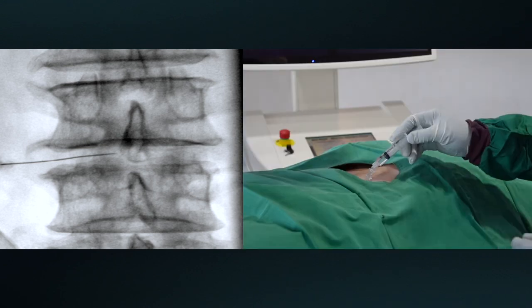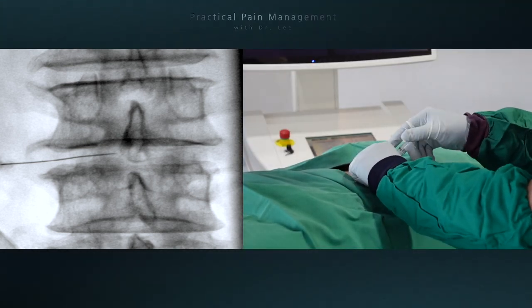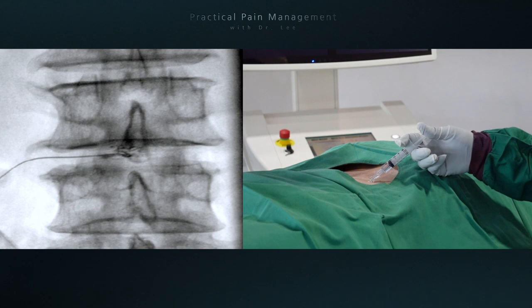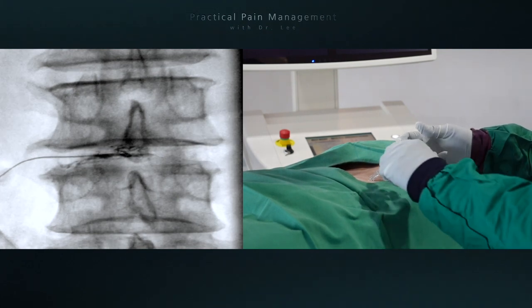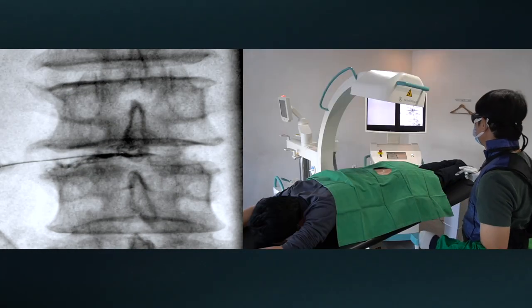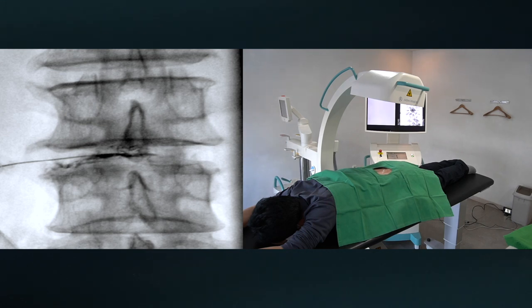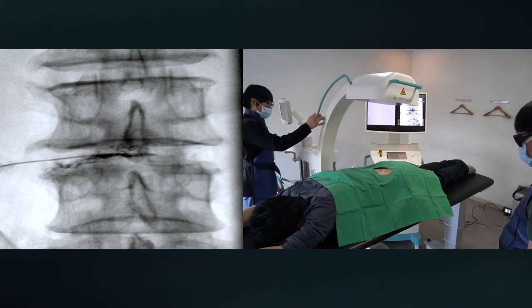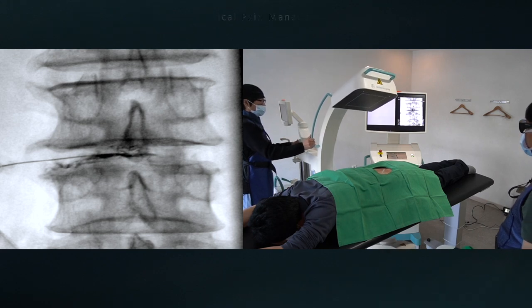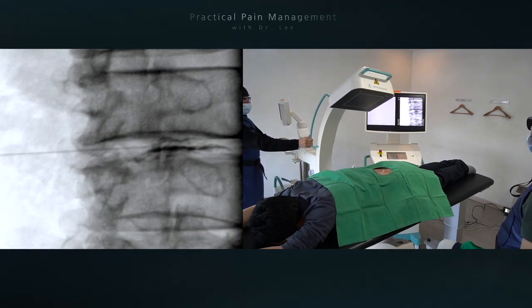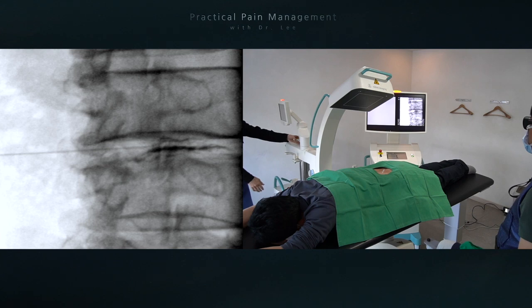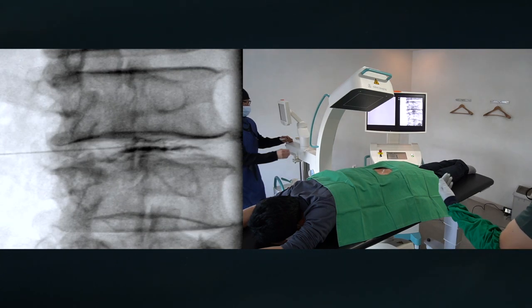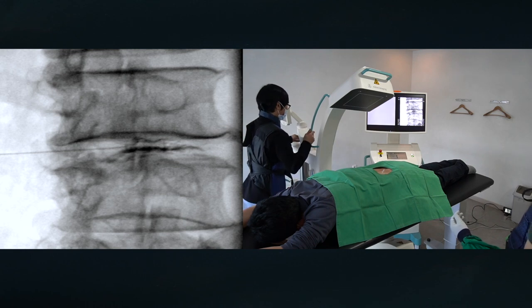I slowly introduce the contrast media into the disc. Control lateral oblique view — both contralateral and ipsilateral lateral oblique views help me evaluate the contrast spread extension.